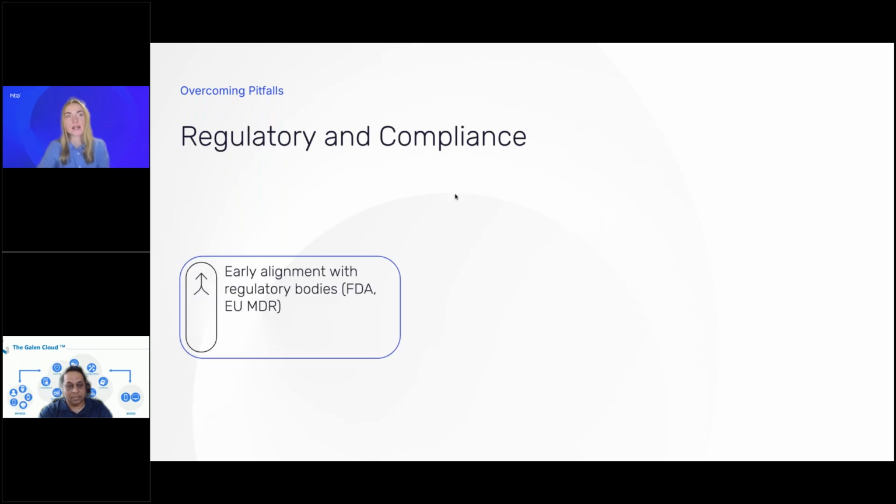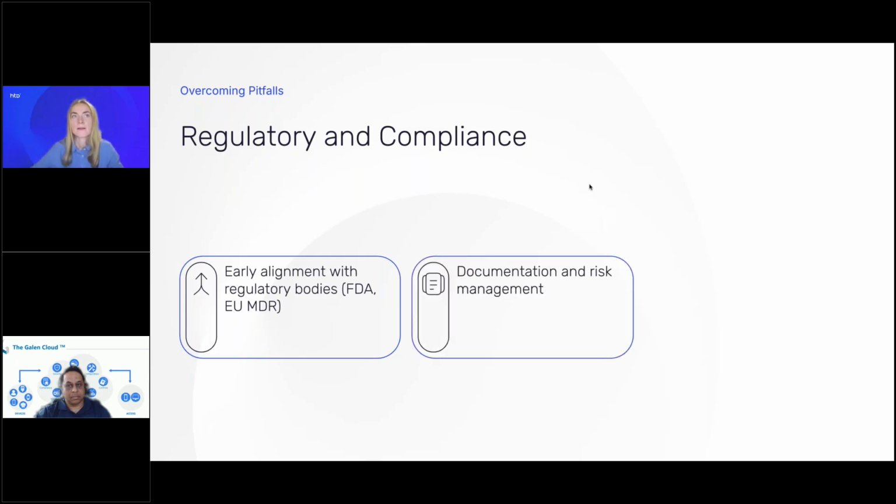So you have to remember to align with FDA or any other regulatory bodies early on. Do a pre-submission, talk with FDA, because you will gather feedback early on, and then you will not have to do a submission, wait a long time, get feedback, and then redo stuff. So I would definitely say early alignment will definitely help.